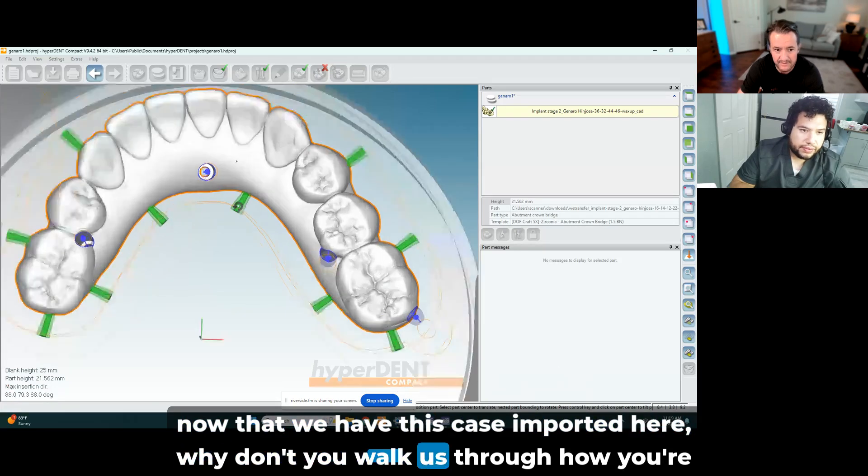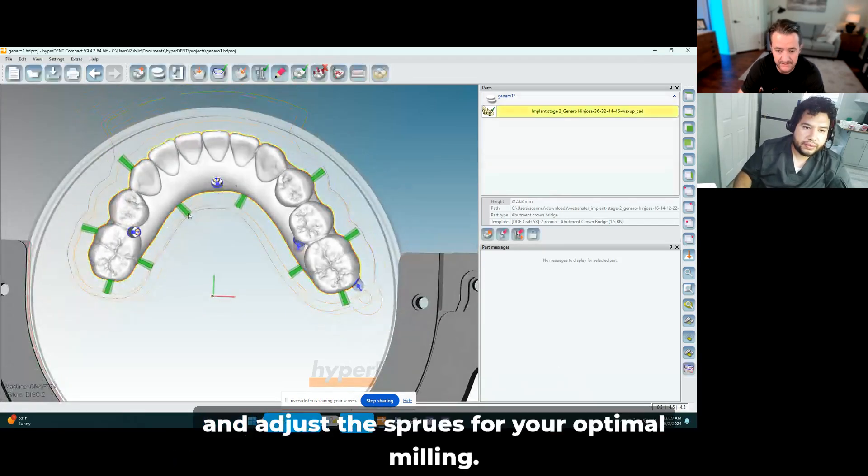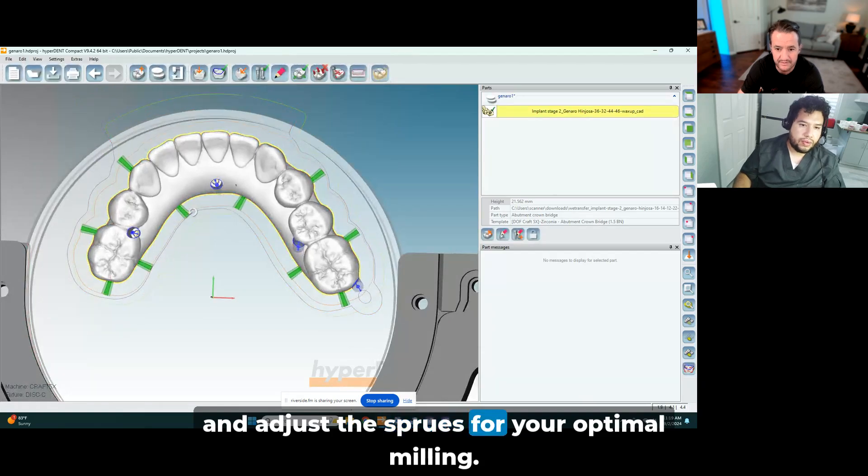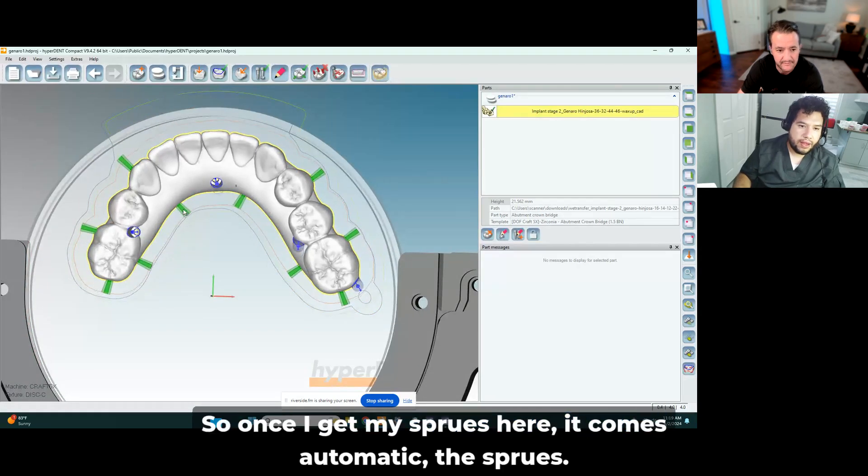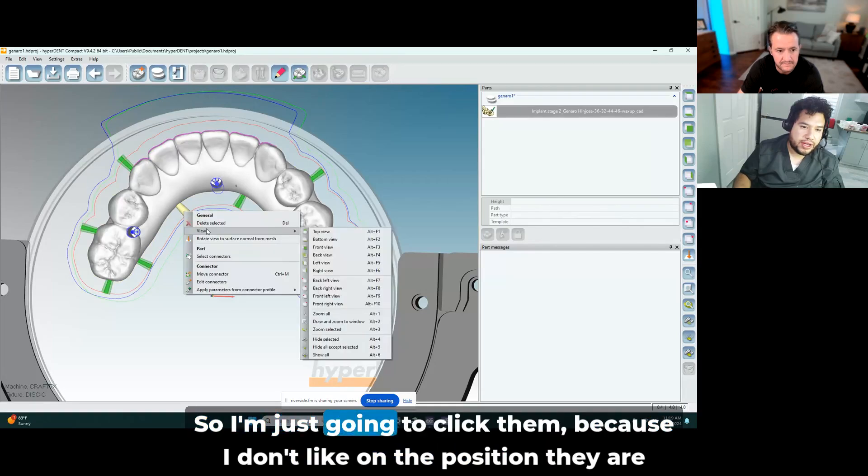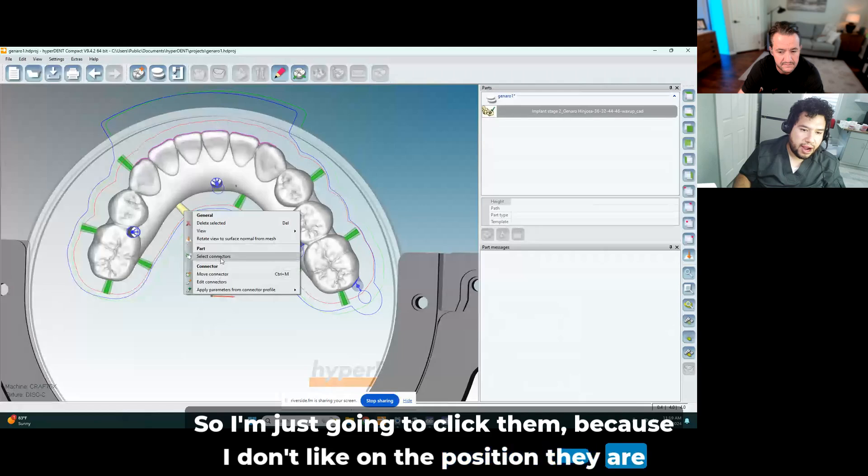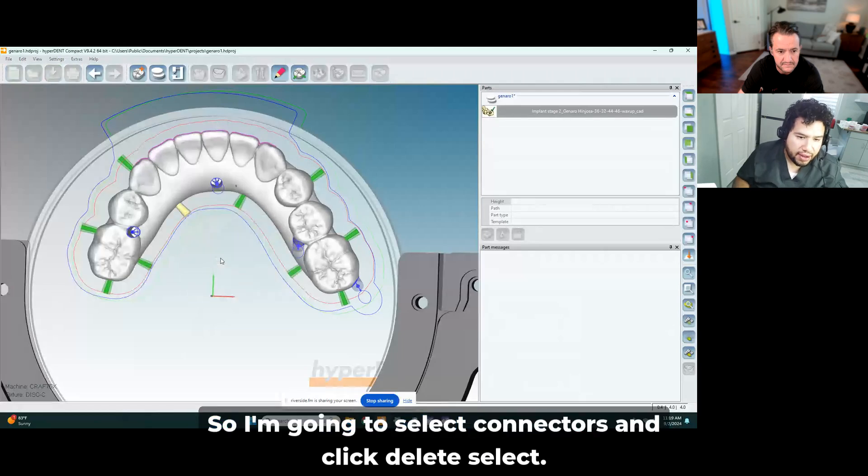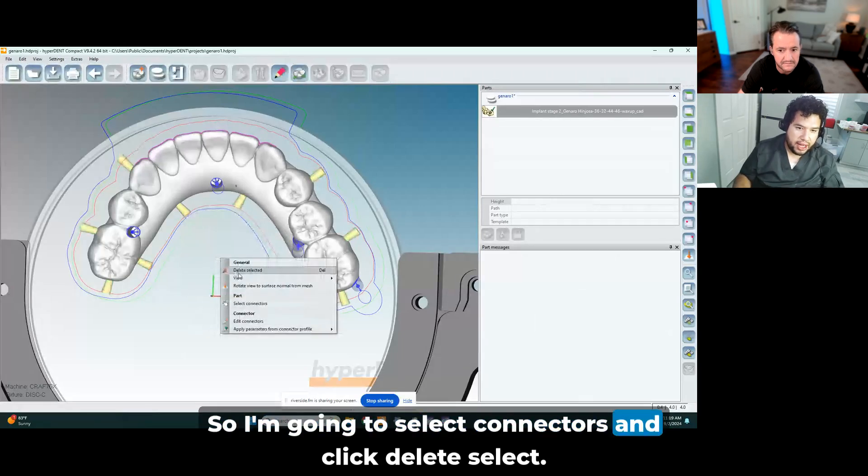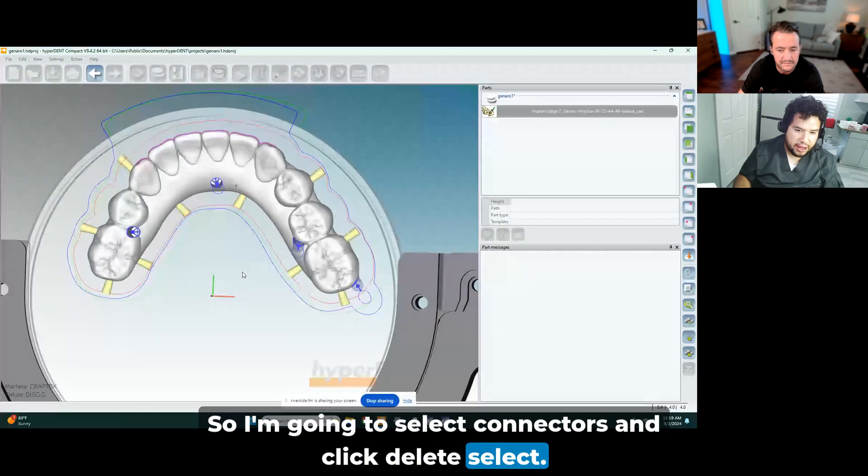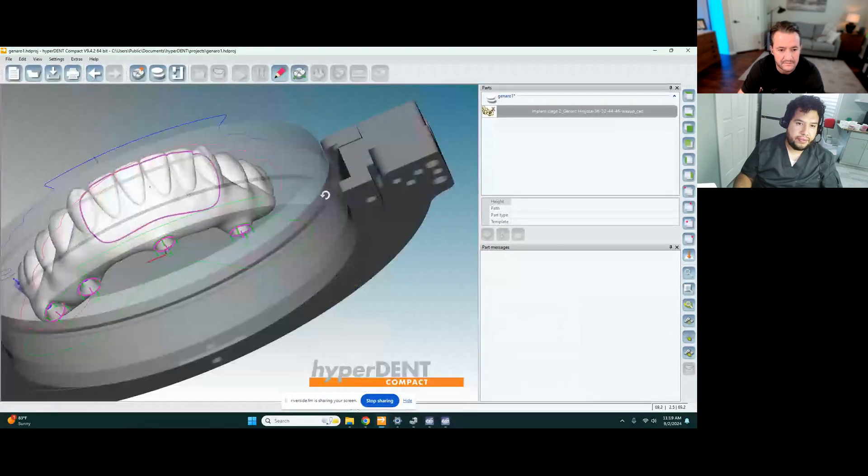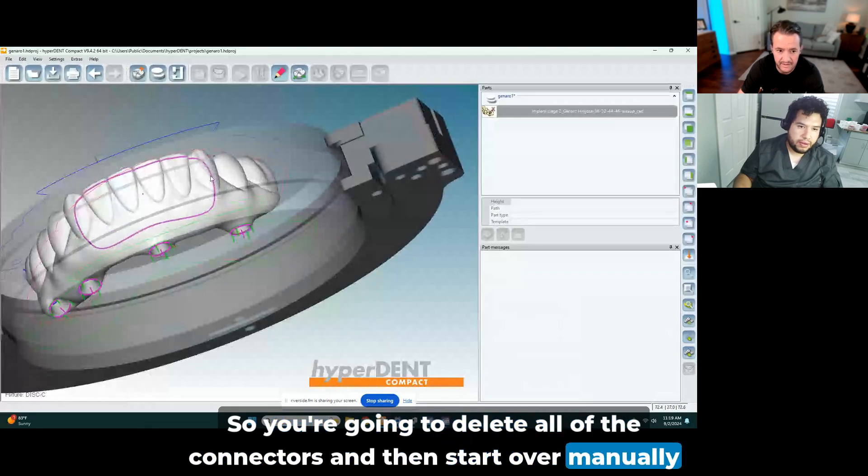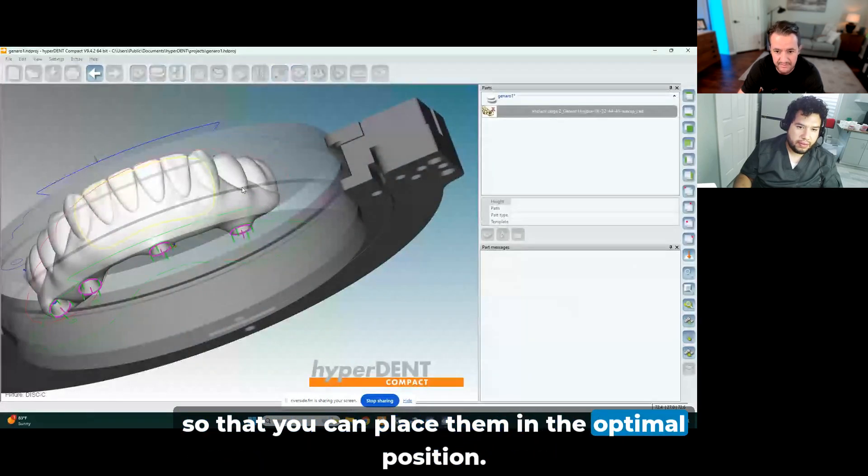Now that we have this case imported here, why don't you walk us through how you're going to manipulate and adjust the sprues for your optimal milling. So once I get my sprues here, it comes automatic, the sprues. So I'm just going to click them because I don't like the position they are right now. So I'm going to select connectors and click delete, delete select.